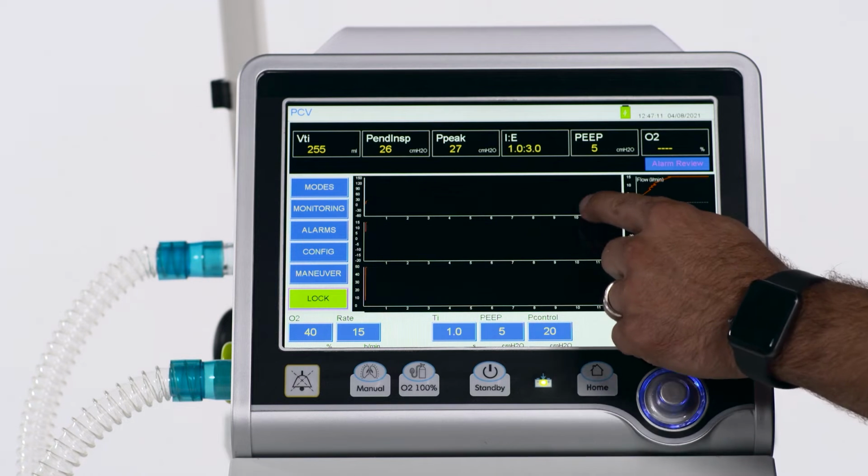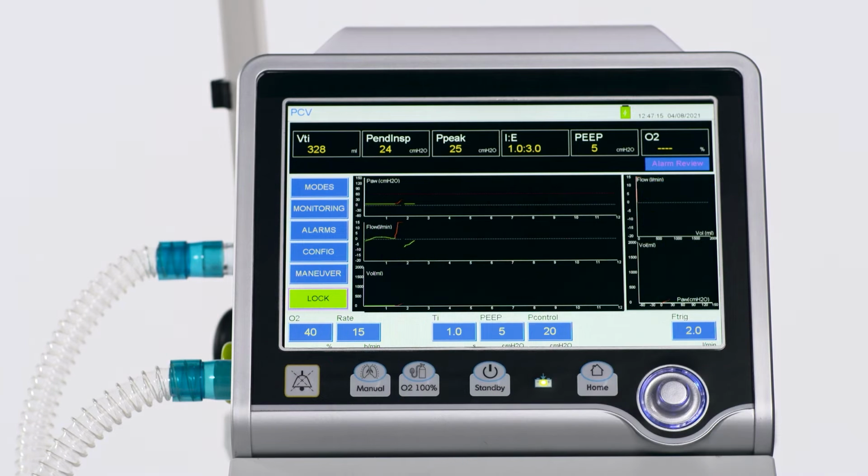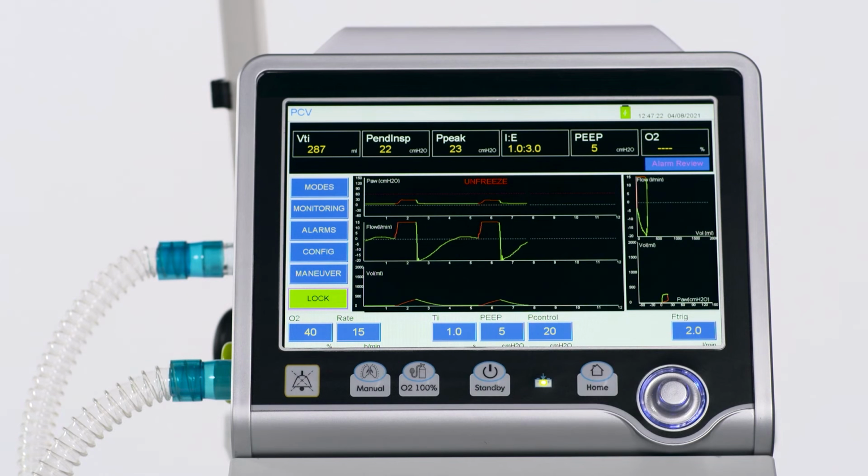The horizontal vector shows time and the vertical vector demonstrates numerical value. By touching each of them, you can change the interval and also the values in the loop. By touching Freeze, the diagrams will freeze, and by touching again, the diagram will unfreeze. It's adjustable.